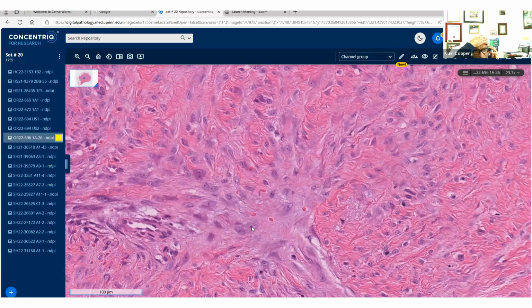But because of the morphology looking very much like NF, nodular fasciitis, we want to confirm by molecular means whether it is in fact a fibromatosis or whether it's in fact a nodular fasciitis. Nodular fasciitis, as you know, a large subset of them carry the USP6 gene rearrangement. So if you have FISH, that's useful. If it's positive, then it's good. You can make a confirmatory diagnosis of nodular fasciitis. If it's negative, it does not rule it out.